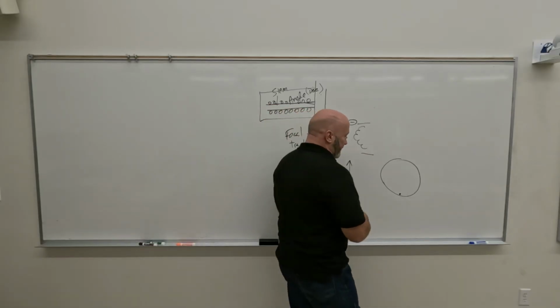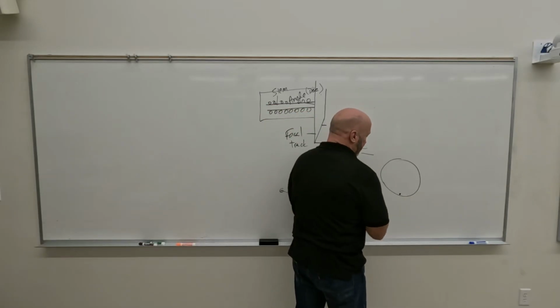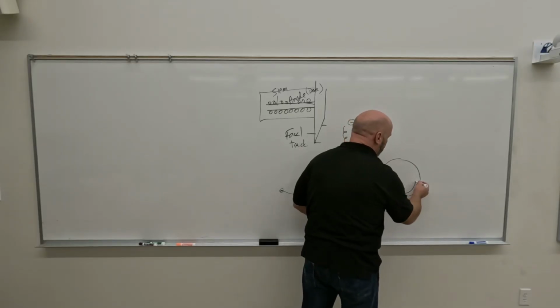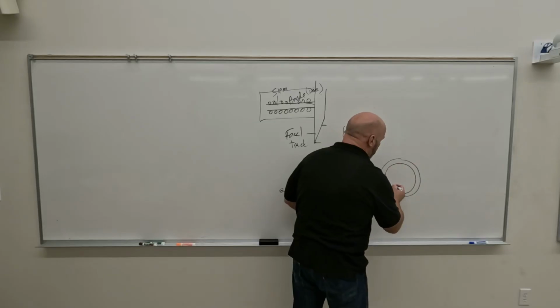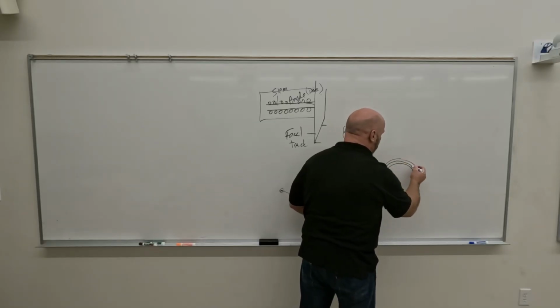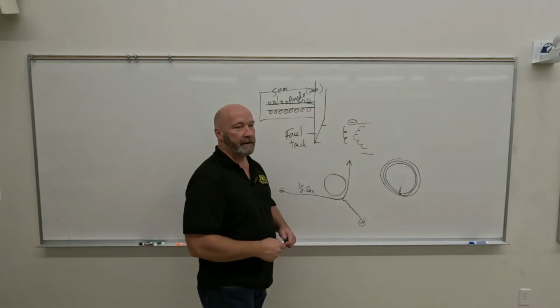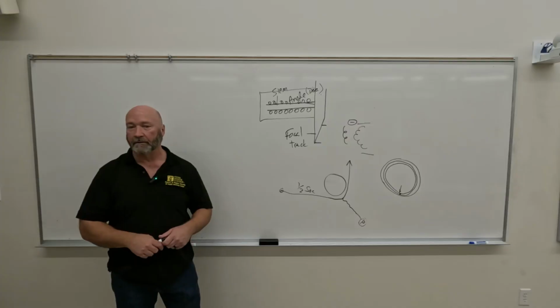But if we rotate the anode, instead of placing all that heat right there, we take that anode and we rotate it around. What's the overall size of, not our focal spot? The focal spot size is not going to change, but our area of bombardment is massive now, right?